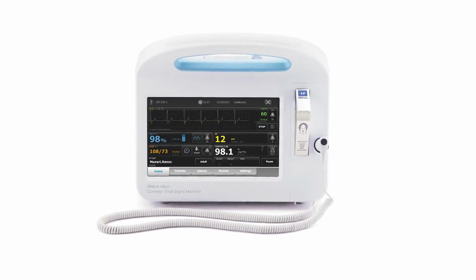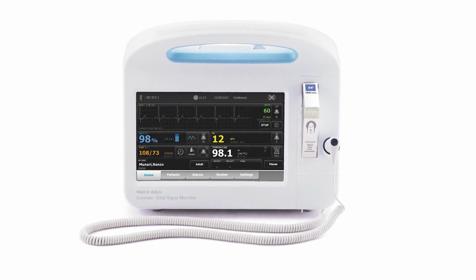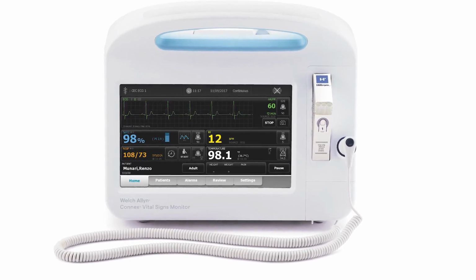Today we'll review the basic functions and workflow of the Welch Allyn Connex Vital Signs Monitor from Baxter. We'll cover how to navigate the device interface, take a set of patient vital signs, and begin continuous monitoring.